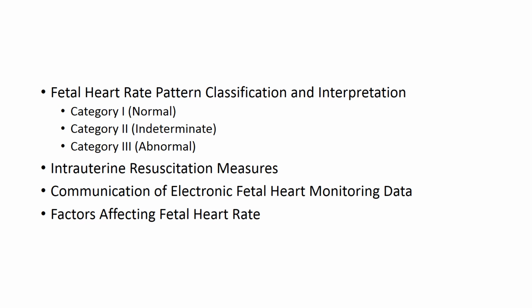We're going to talk briefly about some intrauterine resuscitation measures. And then when you're talking about communication of electronic fetal heart monitoring data, that's when you're talking to the physician, and that's why we're all on board to use the same language. Everyone's calling the fetal heart rates the same things. We're averaging the fetal heart rate baseline range, and we're giving it in increments of 5. And we want to know what factors are affecting the fetal heart rate, and those are some of the things that I've talked about throughout this lecture.